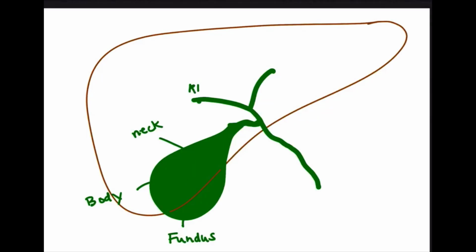You will want to choose then at some point during these 4 pictures where you saw the wall best, where it would be best represented through a measurement to show a correct representative measurement of the gallbladder wall, making sure to always measure on the anterior portion, typically at the gallbladder wall and liver interface.